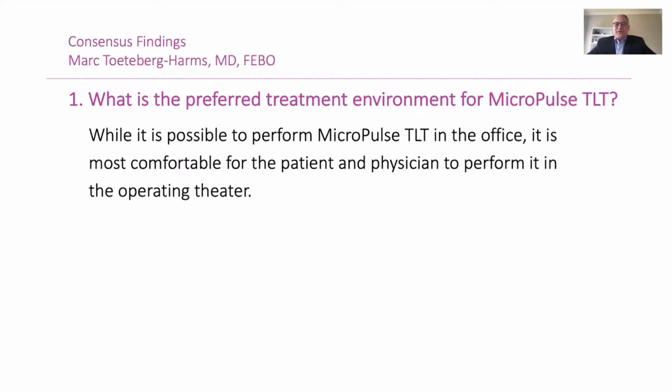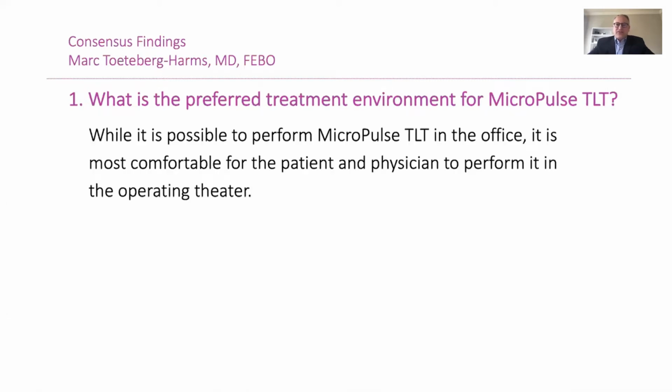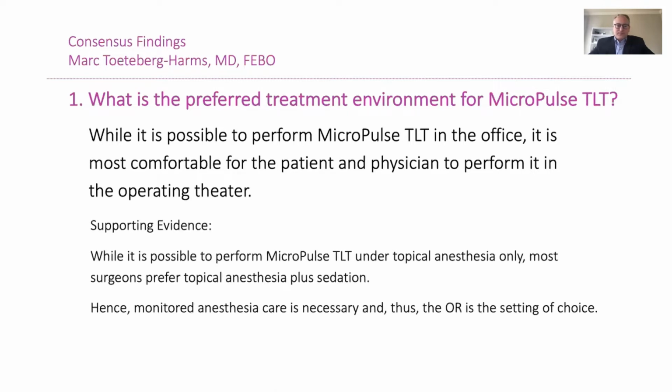Hi. So Thomas said we want to go a little bit more practical today compared to the first webinar. The first thing we talked about in this process is what is the preferred treatment environment for MicroPulse TLT? How do we feel comfortable when we want to perform MicroPulse TLT? In general, it is possible to perform MicroPulse TLT in an office setting, but most of us feel more comfortable, and also the patients, if we perform it in an operating theater.